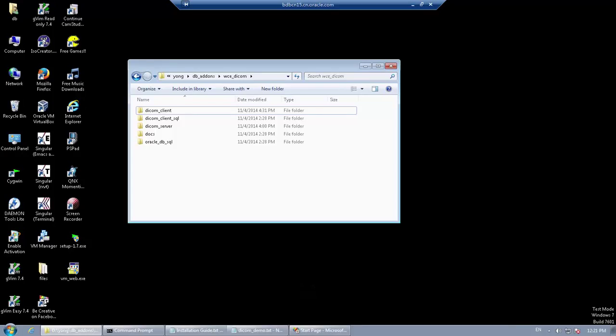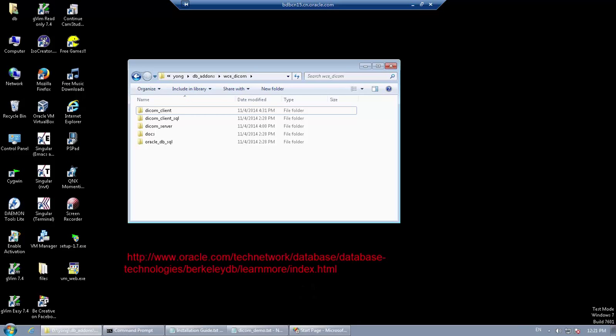Hello everyone, this tutorial shows you how to run the BDB DICOM sample program on Windows mobile devices. You can get the latest program from the OTN network using the URL shown at the bottom of the screen.